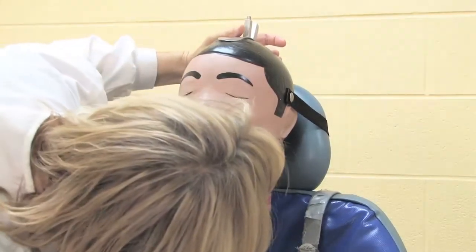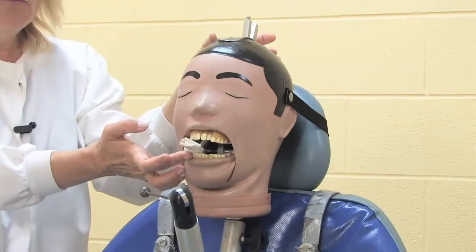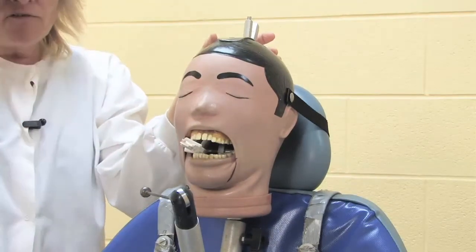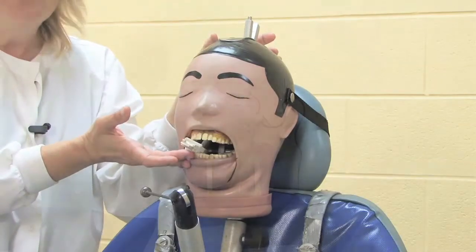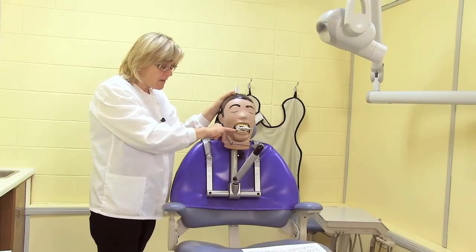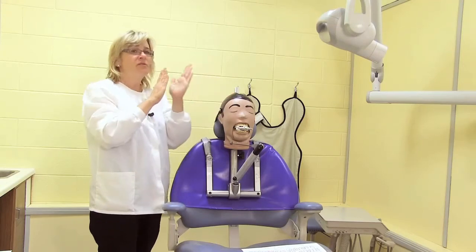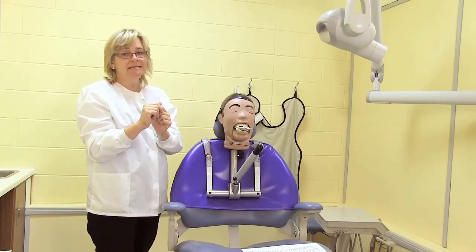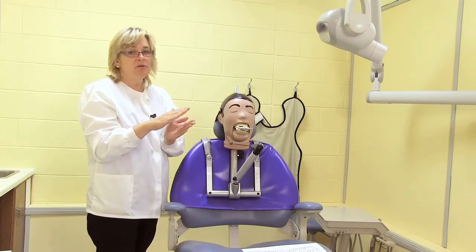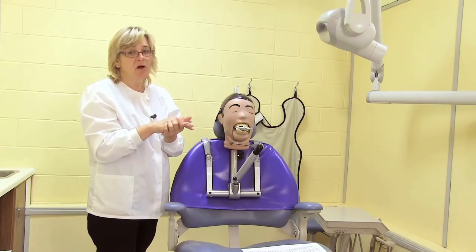So what I often do, if there is any difficulty, if the palate is shallow or the floor of the mouth is shallow, is put in a cotton roll or two to secure the bite tab, but at the same time ensure that the film is flat and as flush against the teeth as possible. As we know with the bisecting technique, it's very important to try to get the film as close to the teeth as possible.